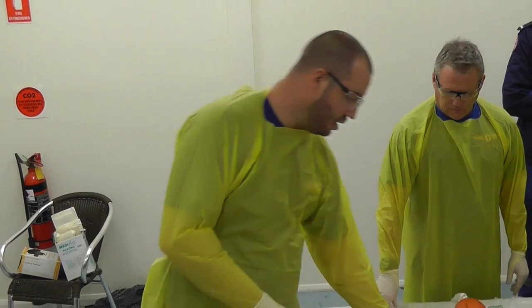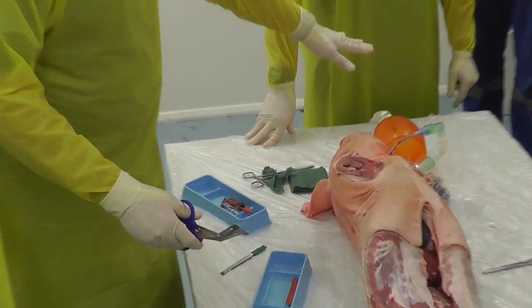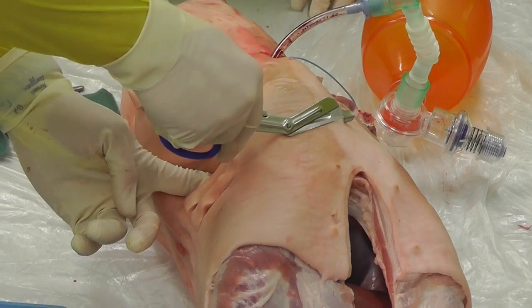You are then going to get your trauma shears, put your finger through the hole, and if you have the cognitive space, get the person ventilating to stop ventilating at that point so you can cut through the other way. You are going to divide the intercostal muscles up to the sternum on both sides.